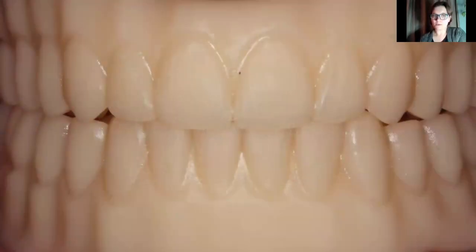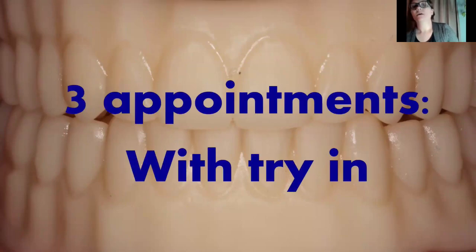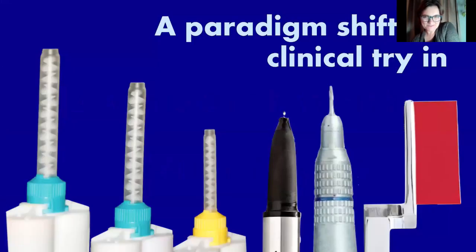And then you'll jump into either a monolithic try-in. So for the reference denture workflow, you can do your impressions, your bite, your scan, roll into a monolithic try-in to verify everything, or if you felt really confident, you could go right to final. This gives us an opportunity to talk about the monolithic try-in.